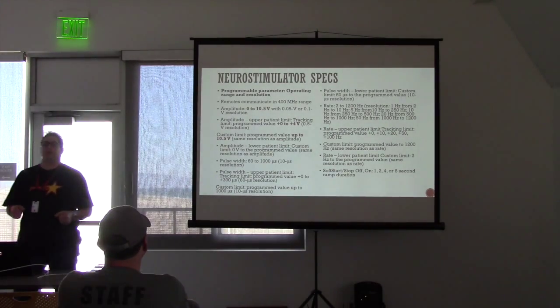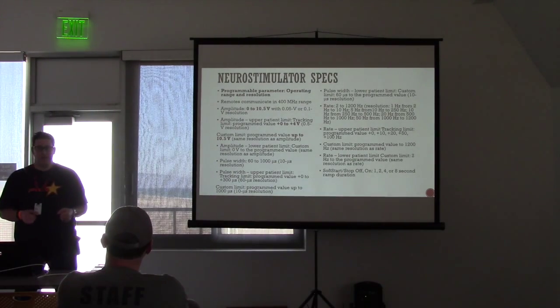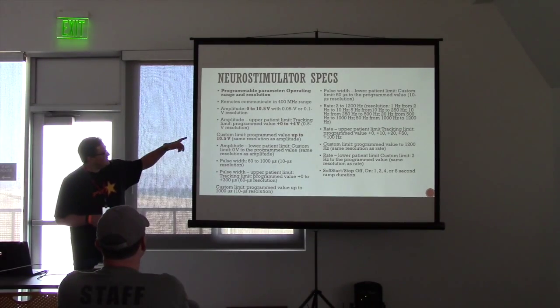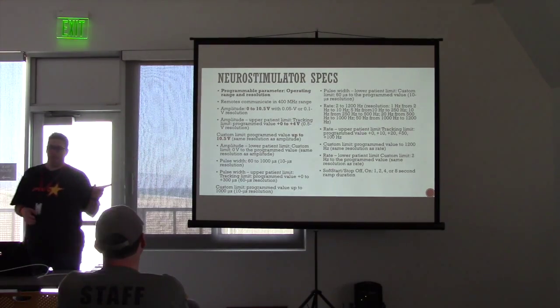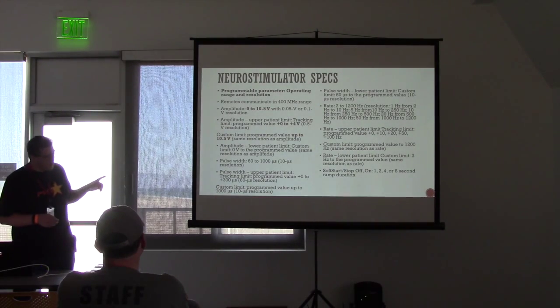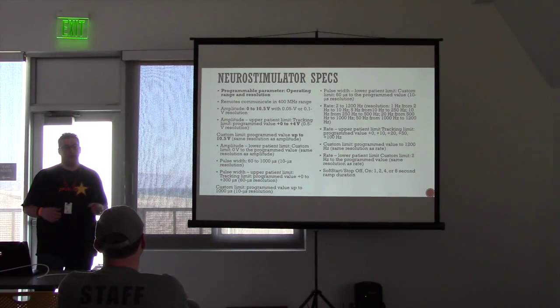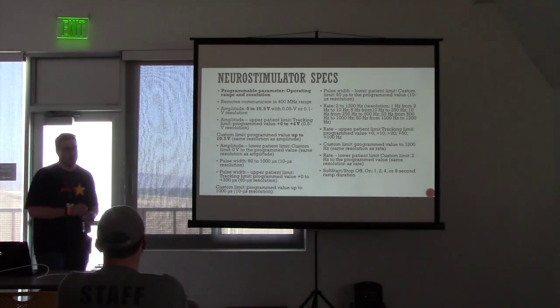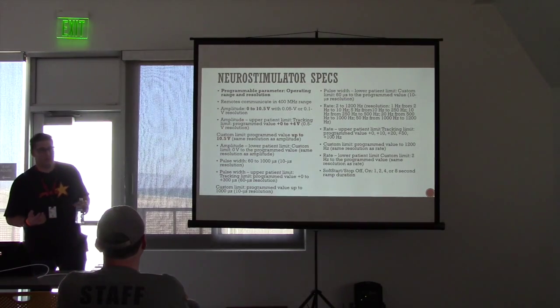If you need a defibrillator and someone's shocking you in the chest, you're talking about hundreds of volts of electricity, right? This is internal, so a little goes a long way here. This has a range of 0 volts to 10.5 volts. If you think about that in the human body, 10.5 volts is a lot of electricity. My wife, at this point, can take no more than 3.4 volts in her body before it starts to be painful, which defeats the purpose of the device because it's supposed to stop the pain. So it's got a pretty large range of electricity, which is, for me, another factor.